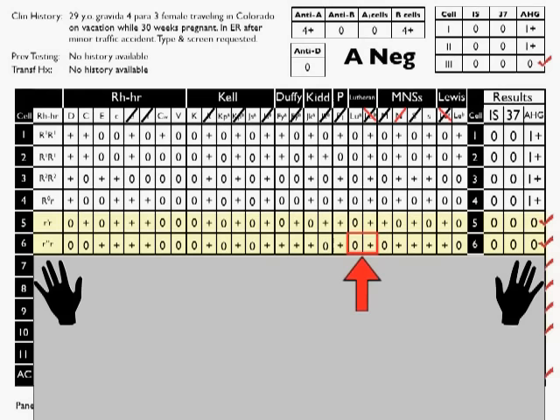Move on to the Kidd system. We have a double dose JKA, put a single slash through JKA. In the Duffy system, we have single dose expression of both Duffy A and Duffy B, so no slashes. JSB, single slash. KPB, single slash. Little k, single slash. You kind of get the picture, and let's move back into RH.